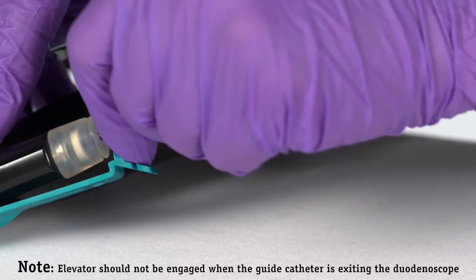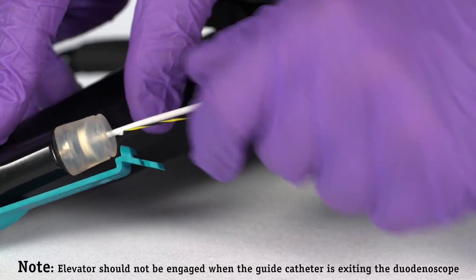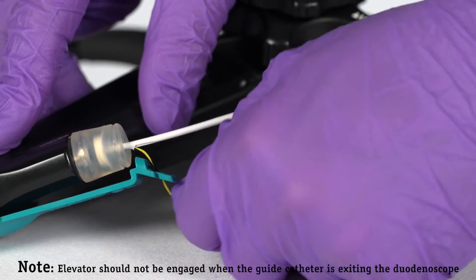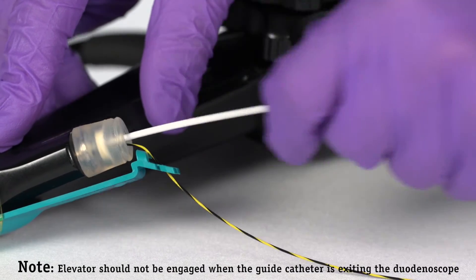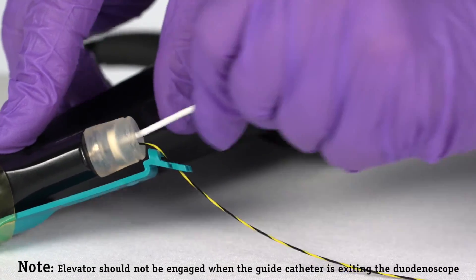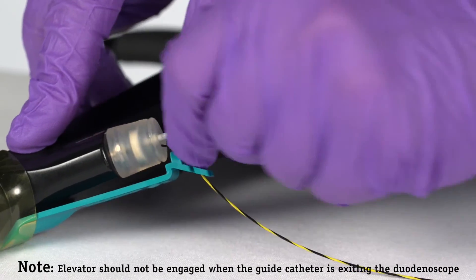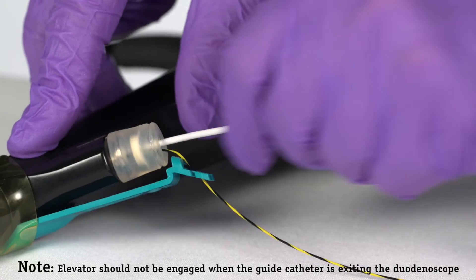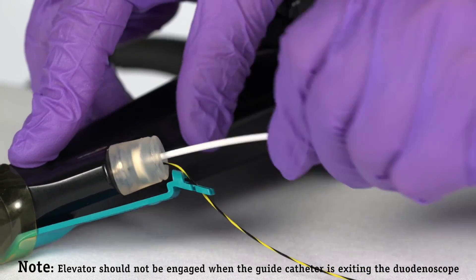Once the guide wire exit port has entered the duodenoscope, re-lock the guide wire to the RX Locking Device and continue advancing the delivery system using 2 to 3 cm short strokes until the stent exits the duodenoscope and enters the pancreatic duct. The guide catheter RO marker and stent can be visualized fluoroscopically.